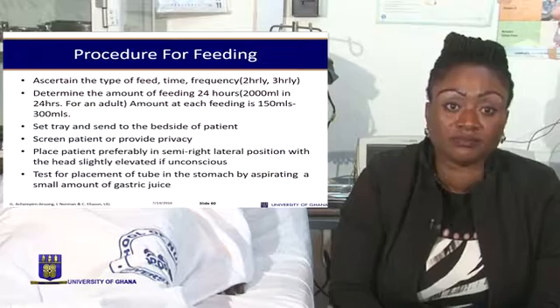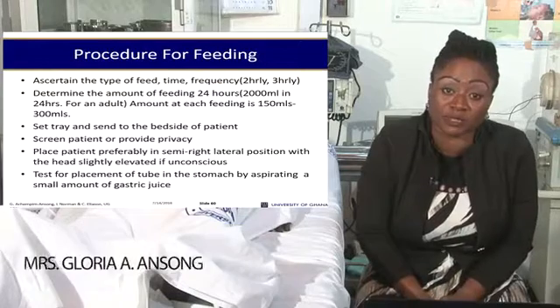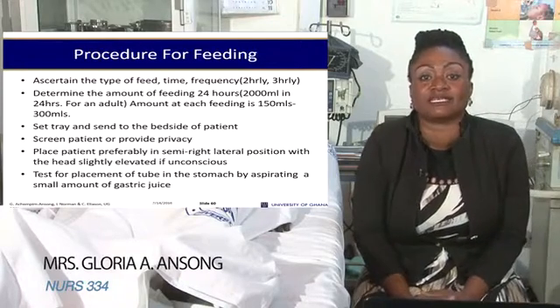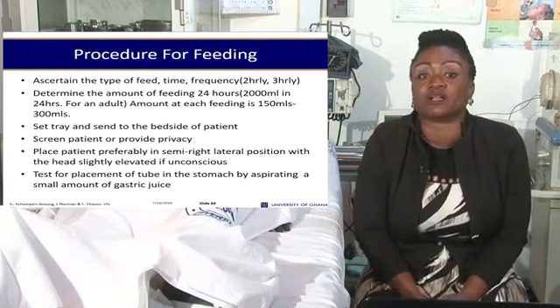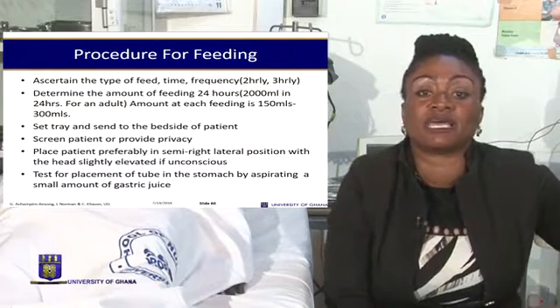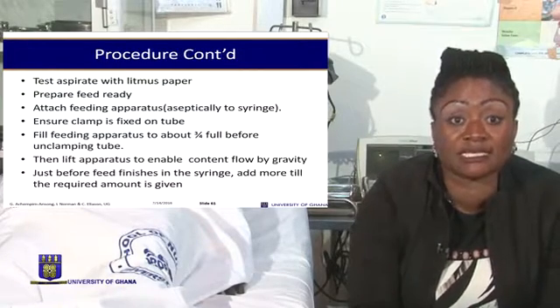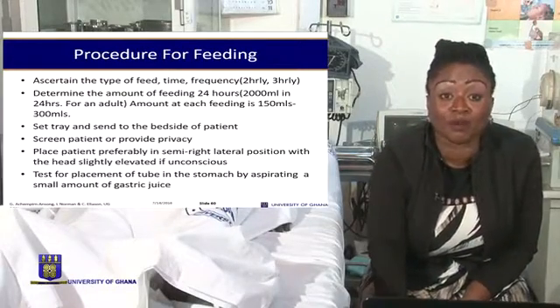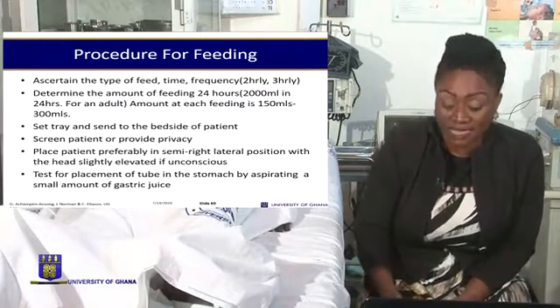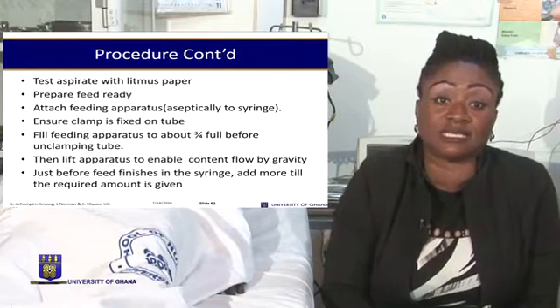for the feeding. So we need to ascertain the type of feed and determine the amount of feeding within 24 hours. Then a tray should be set and sent to the patient's bedside. Privacy is provided, and then the patient is positioned preferably in the right lateral position, because the stomach is found at the left side of the abdomen. Then placement of the tube is tested, and this can be done by use of litmus paper. And because litmus paper may not be common, it can be done by aspirating amounts of fluid, and then we check if it's gastric content.